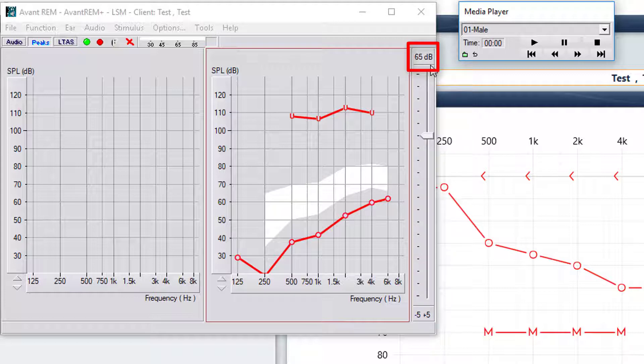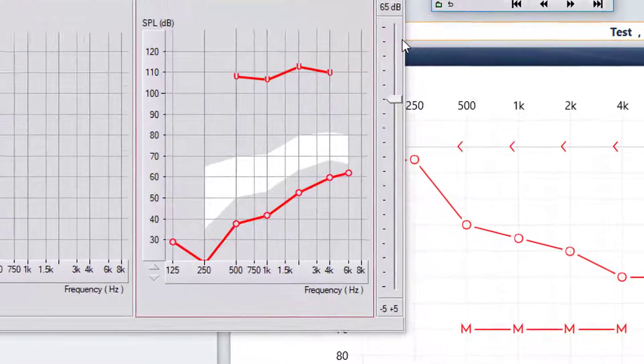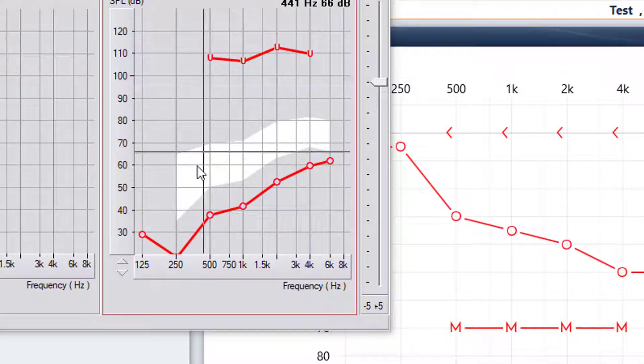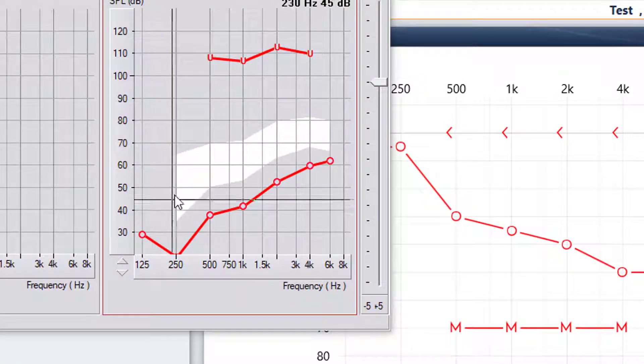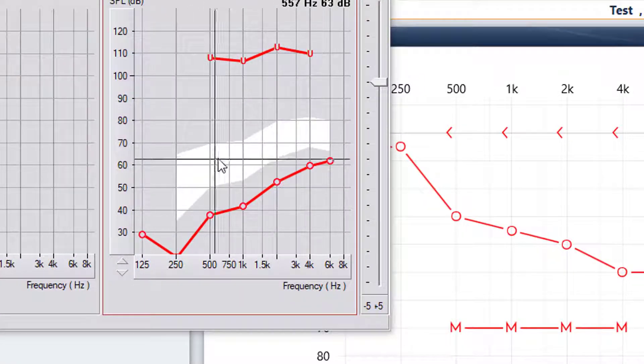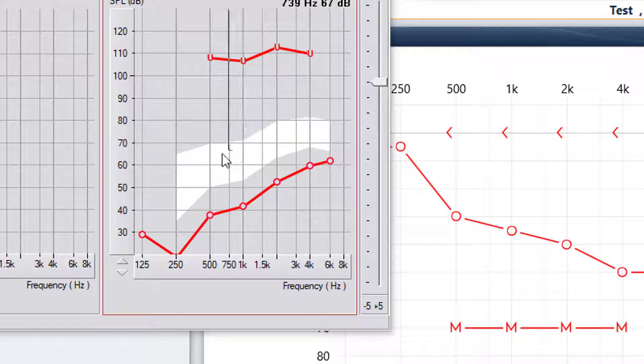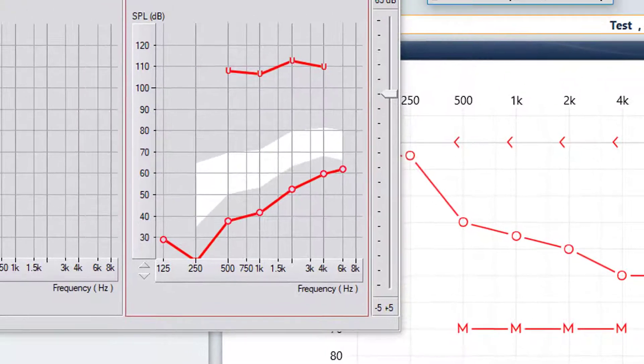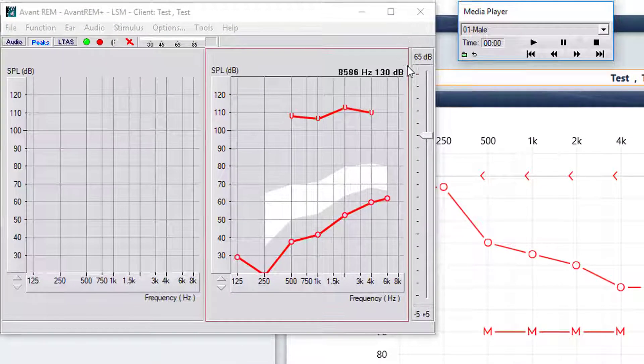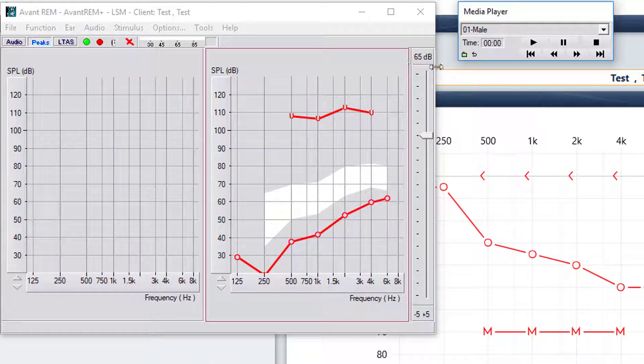And the goal for aided 65 is to get your peaks of speech into the center of the white area to the upper part of the white area. Most providers start with 65 because usually the soft and loud sounds fall into place.